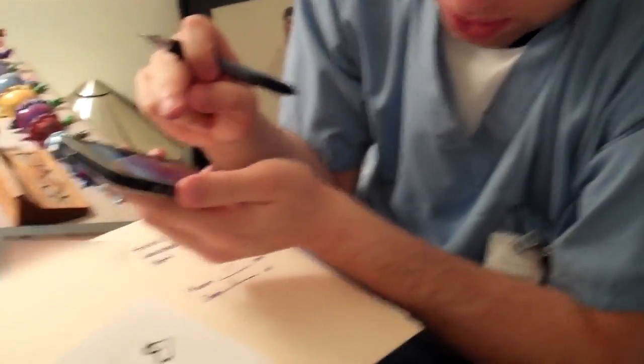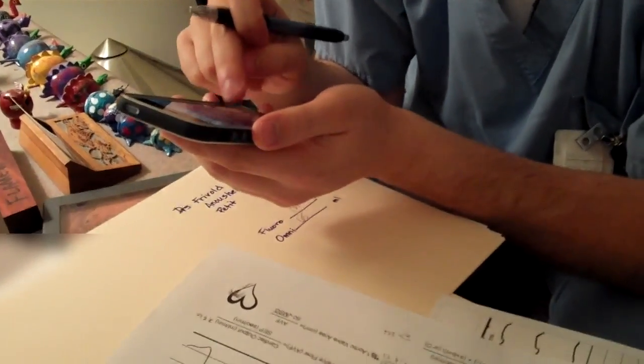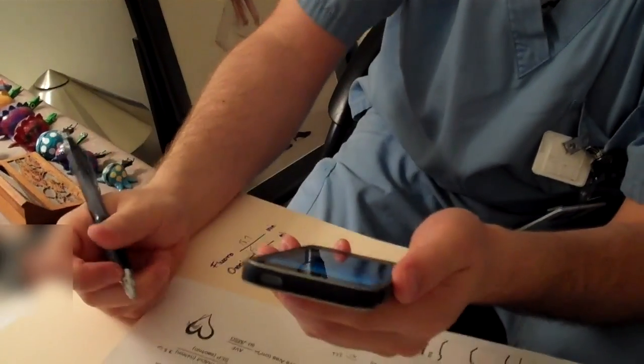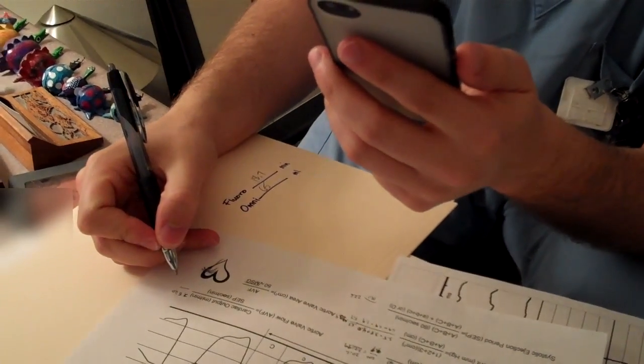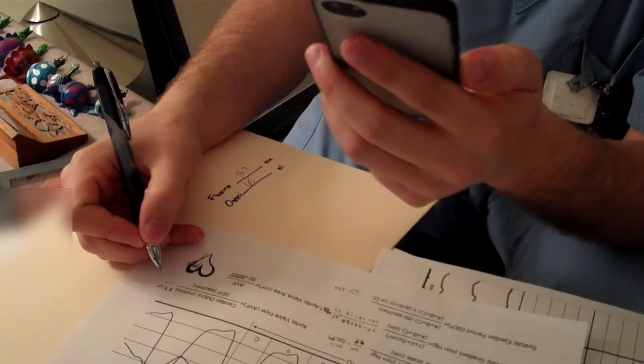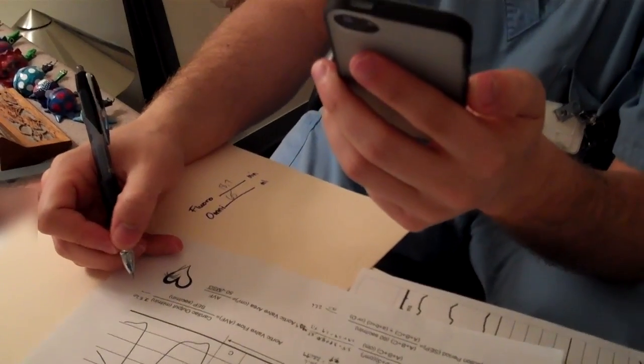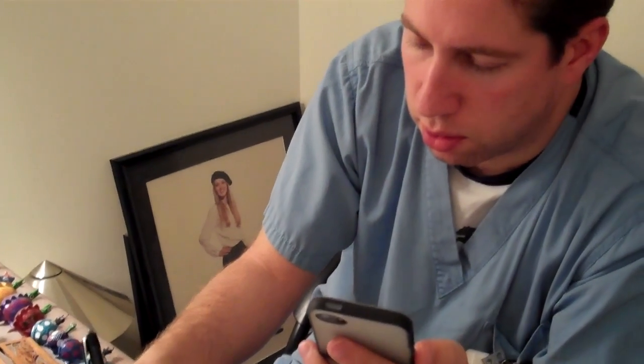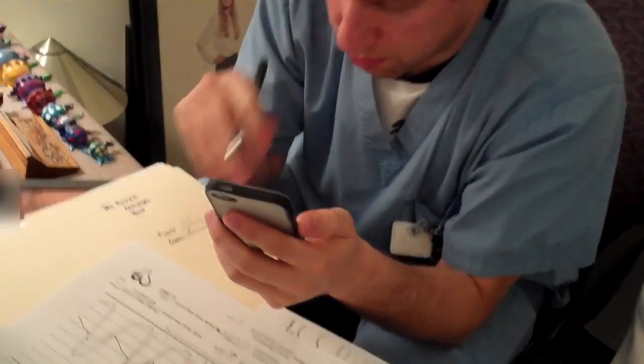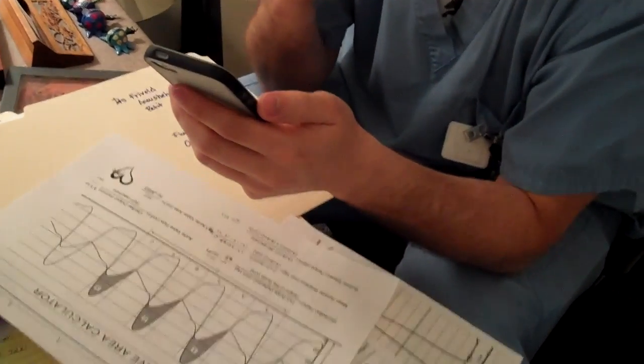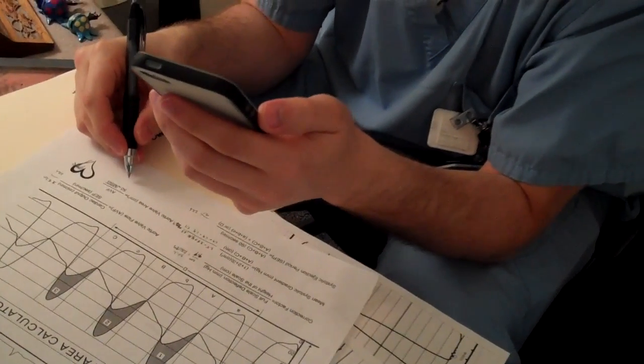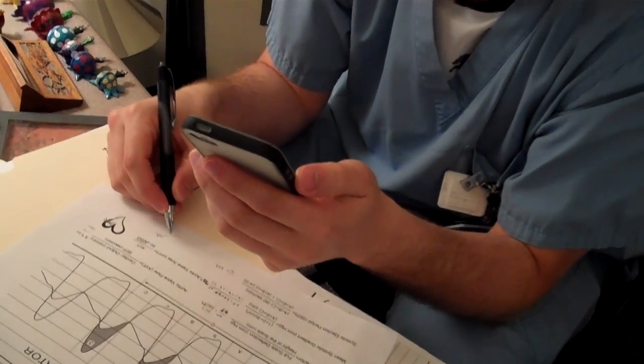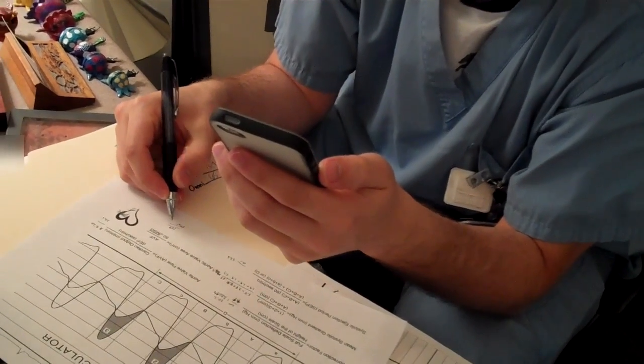I have the mean gradient by 22.6 seconds. 169. That's the numerator. That's the AVF. 0.53 is the valve area. Because his output is not very high. So not a very high output will give you a very small numerator. And so the denominator is going to be 6.5 or so times 50. It's going to be a fairly large number. That's 76 basically.